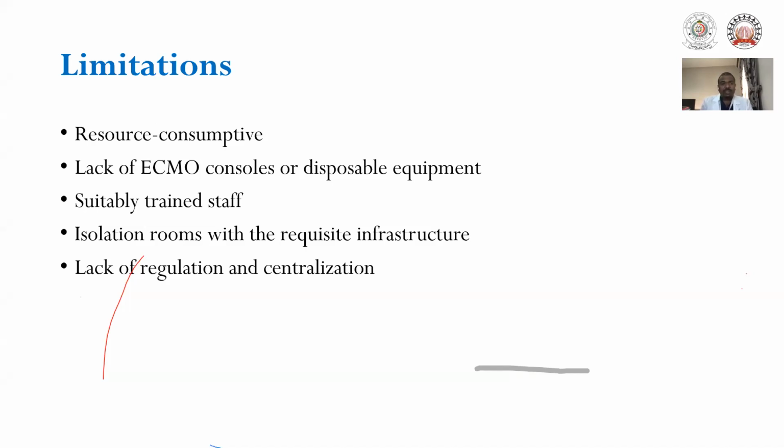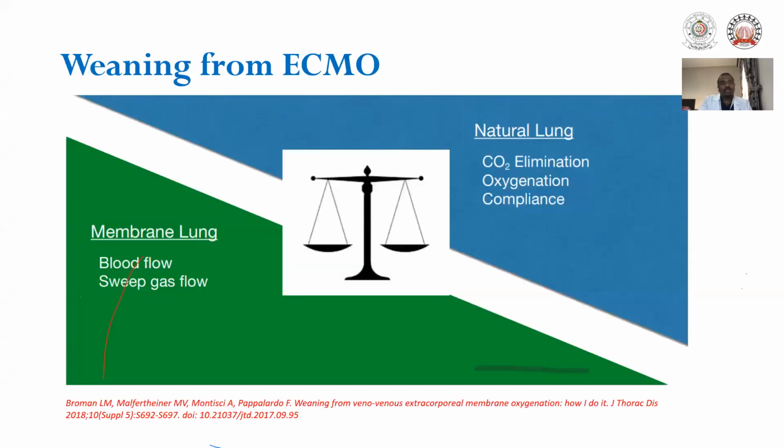I think they are providing some regulations, and they have a flying squad as well for providing support, but their service will be limited at this point when there is a huge requirement. They cannot fly down to all the places where they need the ECMO support. And training at this time, it is not a suitable time to train the people as well. So we must know the limitations very well before we elect any patient for ECMO.